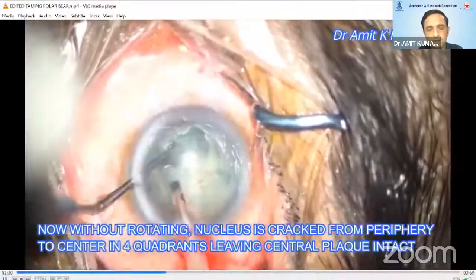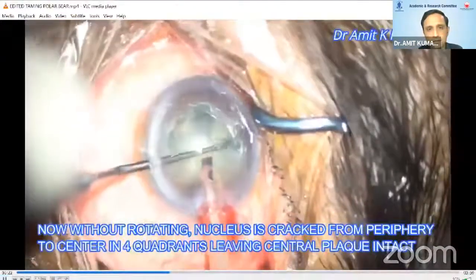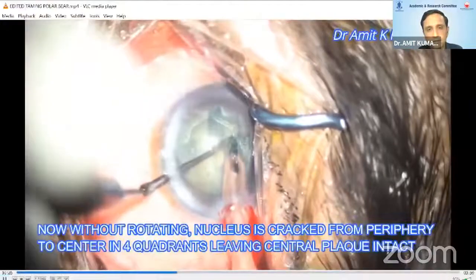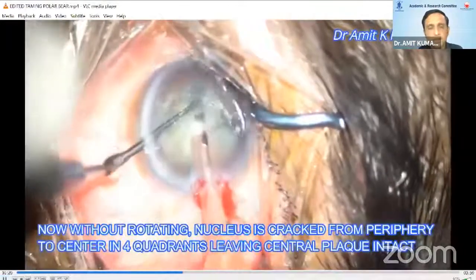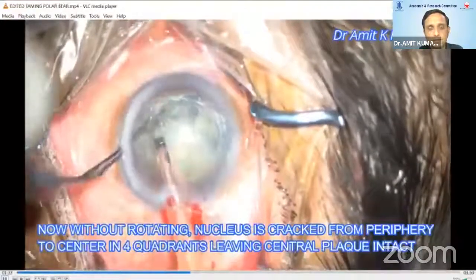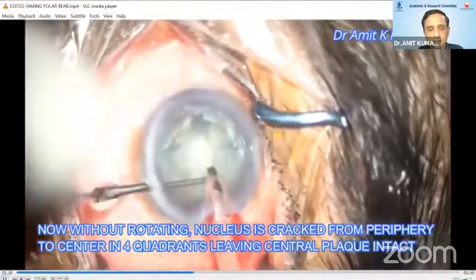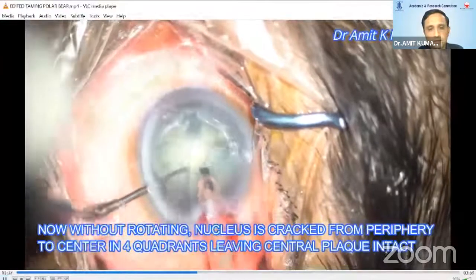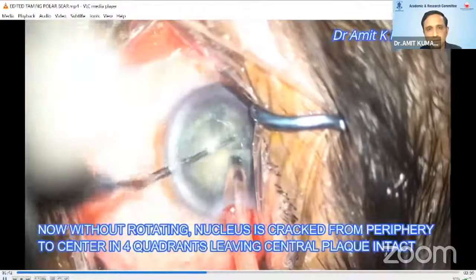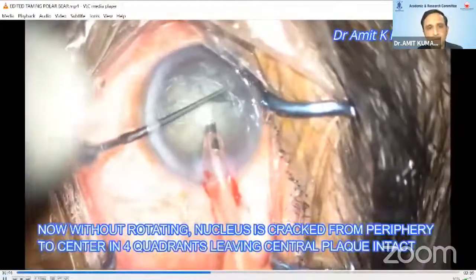Now, without rotation, the nucleus is cracked in all four quadrants from periphery to center without disturbing the central plaque. The separation should be proper, gradual and sharp in all four quadrants. You can take multiple attempts but separation should be proper from periphery towards the center, keeping the central plaque attached as it is — so that now you have four separate pieces attached centrally like flower petals.